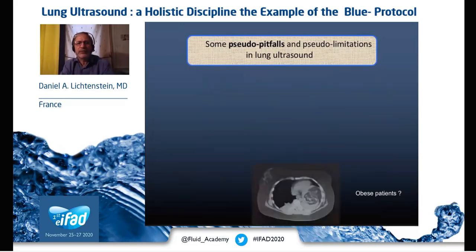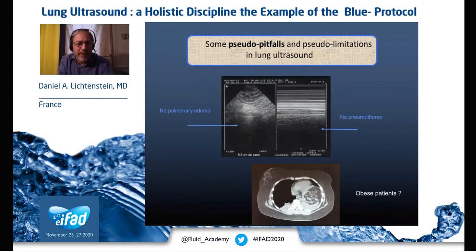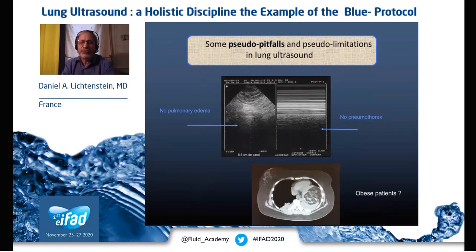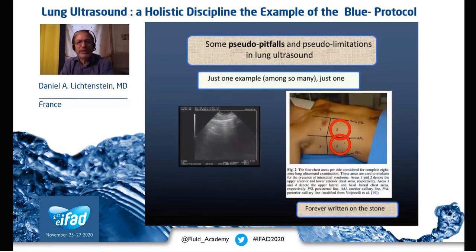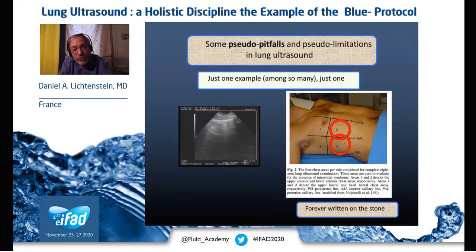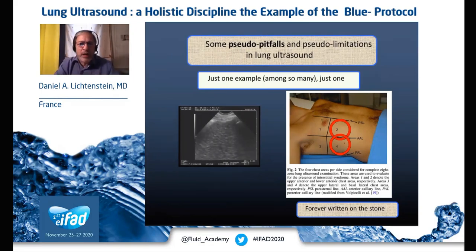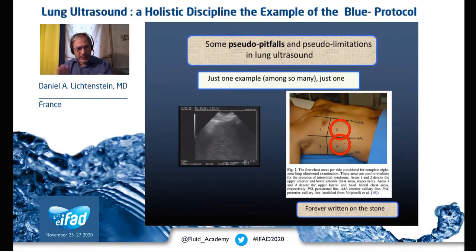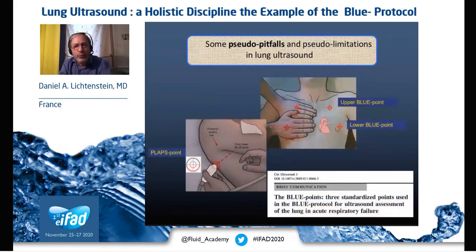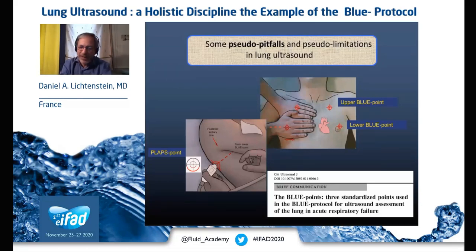In the BLUE protocol and critical ultrasound, here I believe this is a thorax of a very bariatric patient. In spite of that obstacle, I can clearly see no B-lines — that is, no pulmonary edema — and the seashore sign, meaning no pneumothorax. We can also see zones 2 and 4 of the international consensus conference on lung ultrasound; placing the probe there could mislead you into thinking you see a huge lung consolidation, which is actually the liver. Instead, we use the BLUE points, which allows simpler, more accurate medicine.